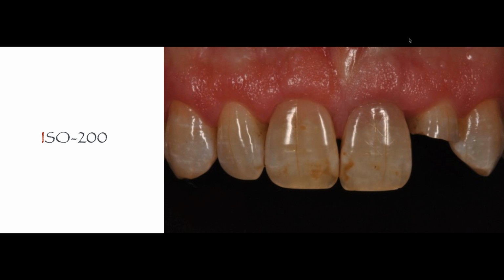You can see the crease lines. You can see all the stains. You can see the orange type of texture on the gingiva of this patient. You can look at every single detail on the teeth of this patient, and they're there because we have the right settings. Now, don't forget, it's not only the ISO, it's not only the f-stop, it's not only the shutter speed. It's a combination of all these that give you a high quality photo.